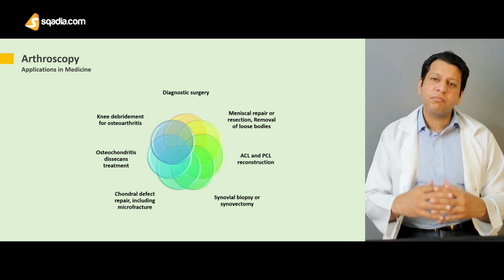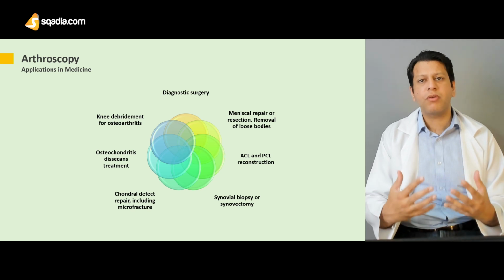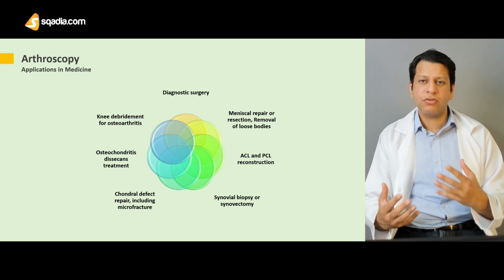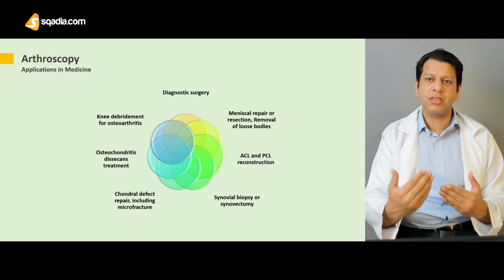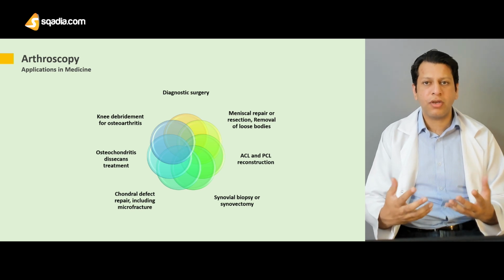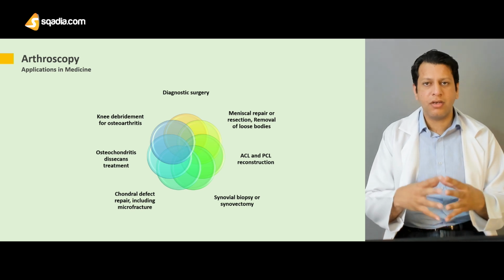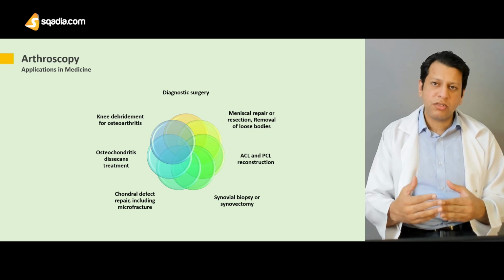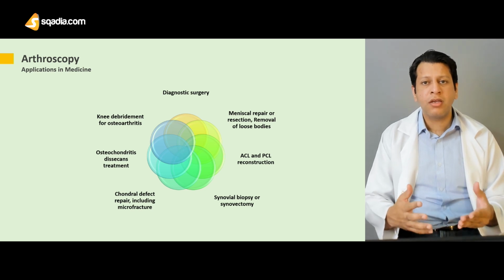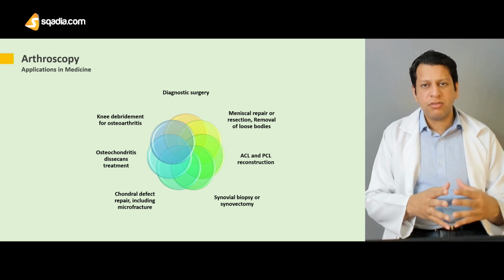But this was practiced at one time, because there was a thought process that instead of straight away going for TKR, you can delay the osteoarthritis by doing debridement of the knee with use of an arthroscope and using lignocaine to be infiltrated into the knee during arthroscopy. So that was one thought process, but nowadays it has been made redundant, because TKR has mainly replaced it for end stage osteoarthritis.